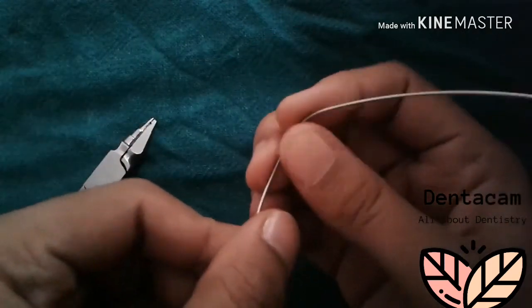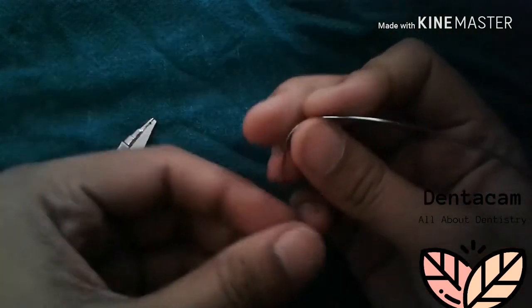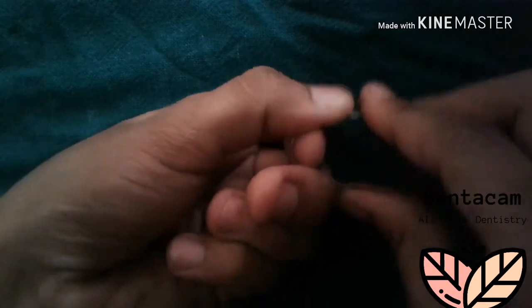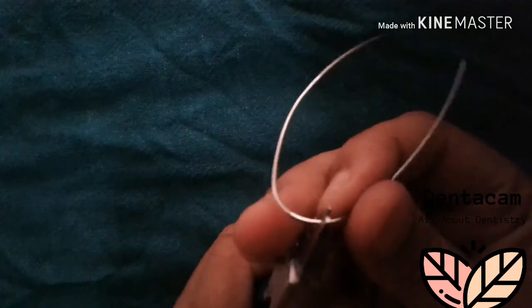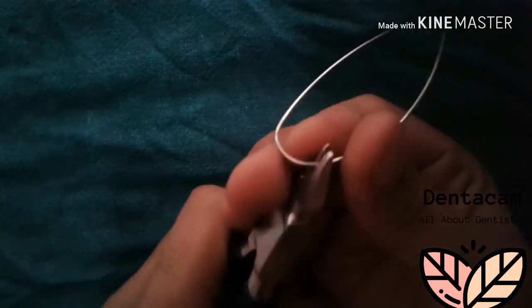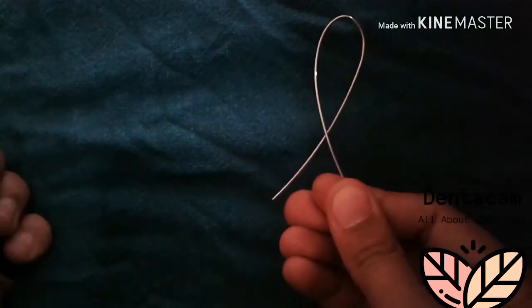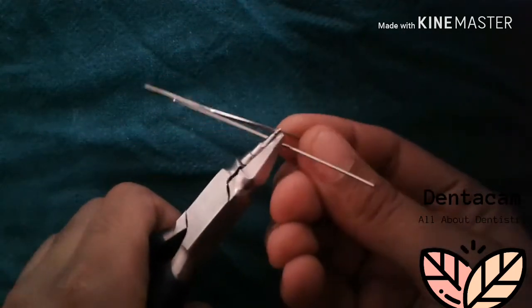It should be a smooth curve without any sharp bend. Compress the U-loop once the U-shaped wire is ready.